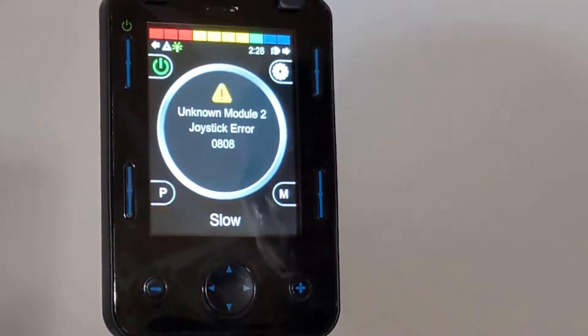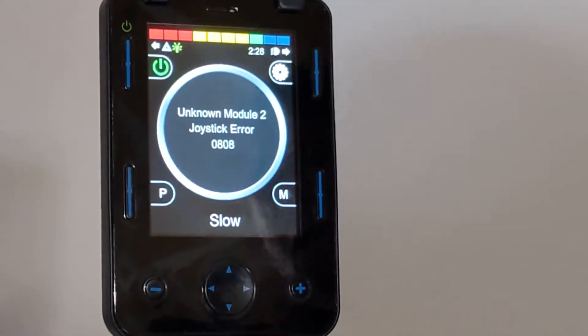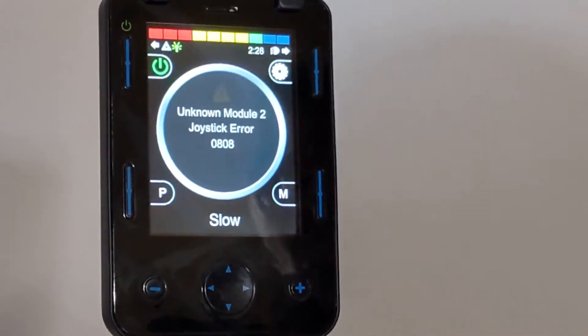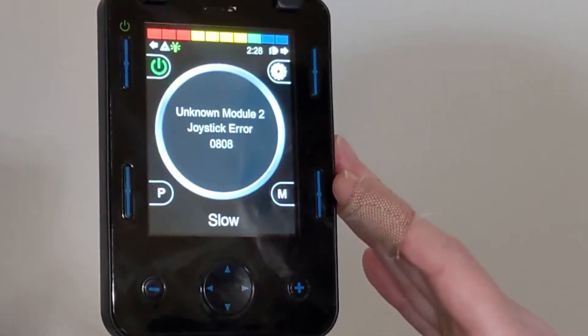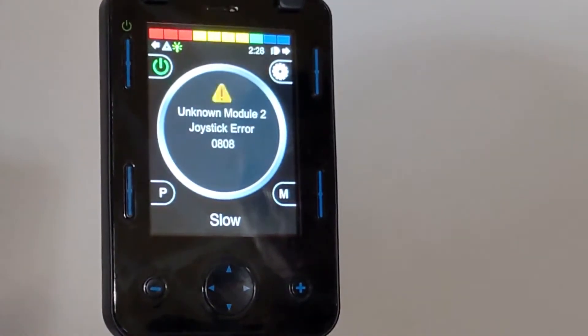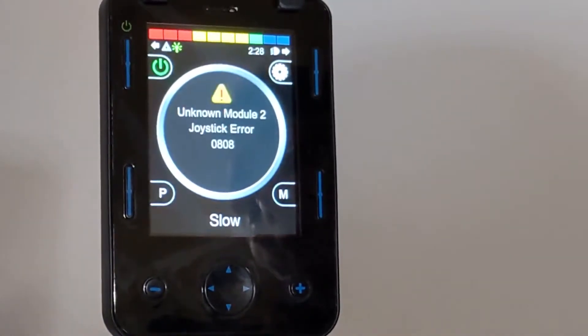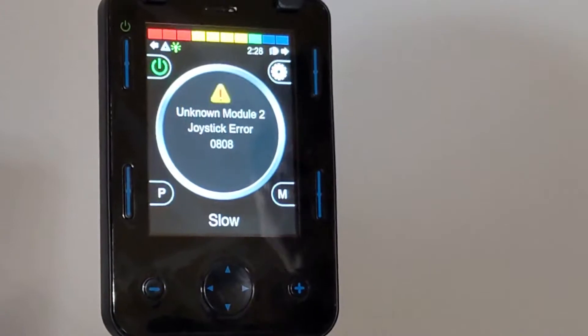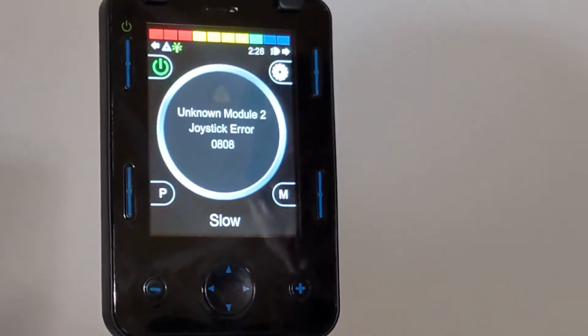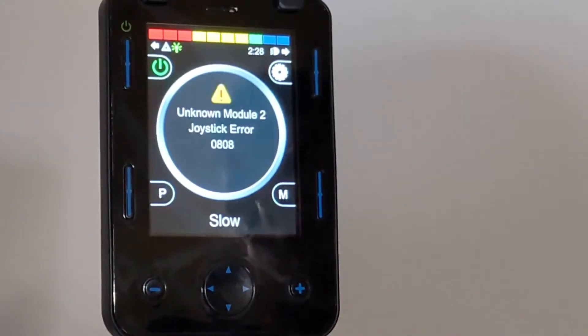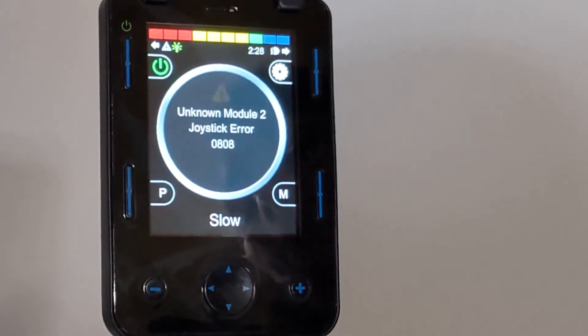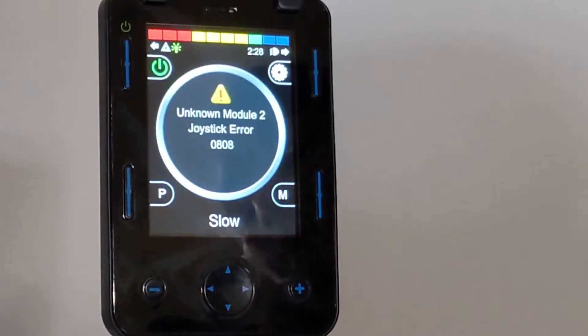Here we have our Permobile F5 wheelchair and an Omni 2 display, and we're going to program it for Ability Drive. Programming it for Ability Drive is very similar to setting up a head array.